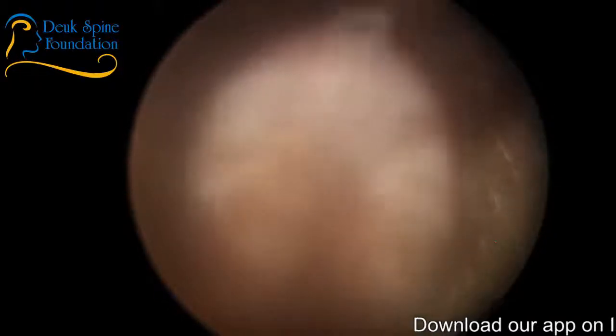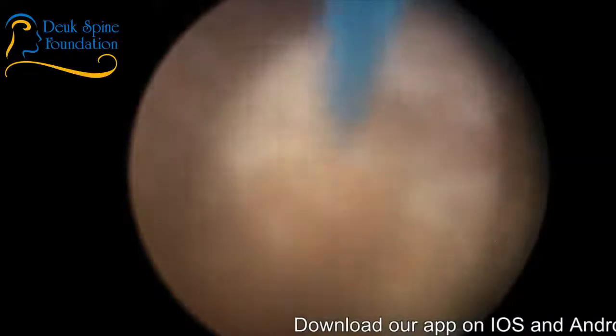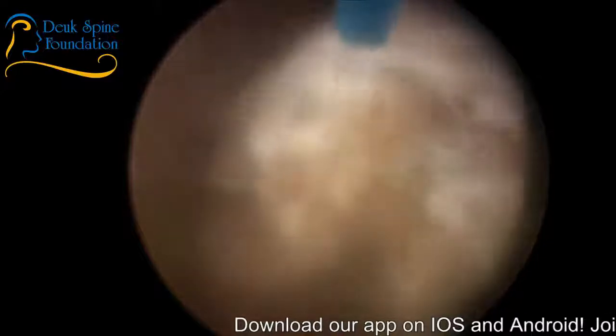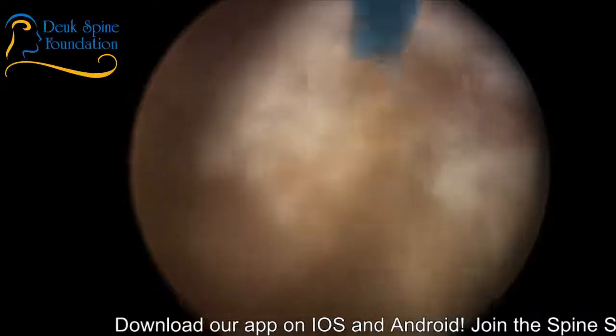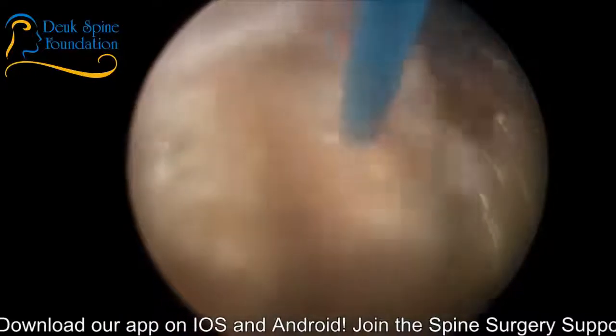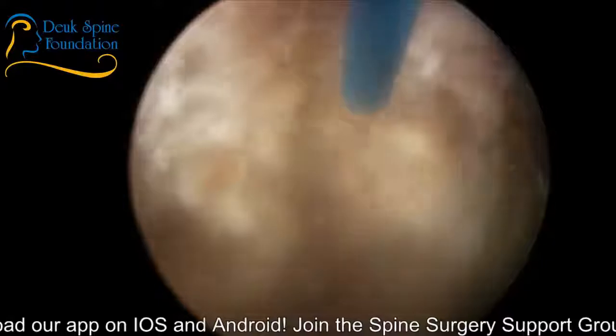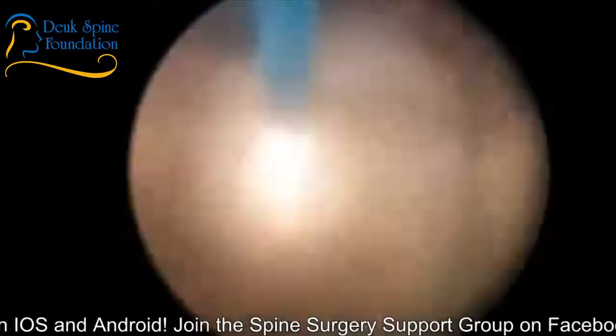There's some fat in the epidural space. We are right at the neuroforamen entrance, just outside the disc. This is all bone spur. And I'm not going to ever be able to remove all the bone spurs with any surgery. There's no surgery in the world that can remove all the bone spurs.